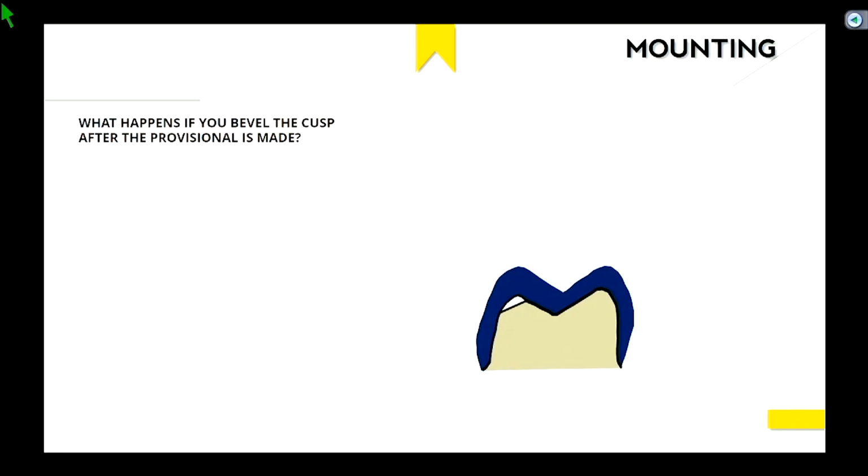Okay. So think about all the steps that you have in your fabrication process. Well, what if you get a bubble in your wax up? Well, what if you get a bubble in your impression material? What if you get a bubble in your investment? All these questions, yes?